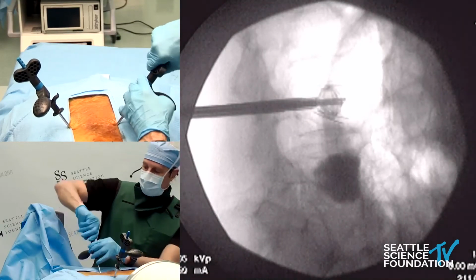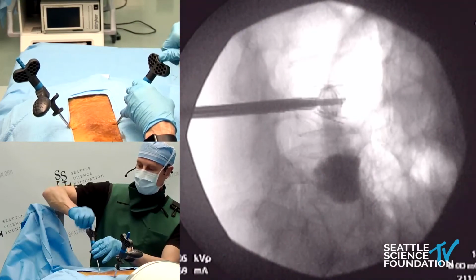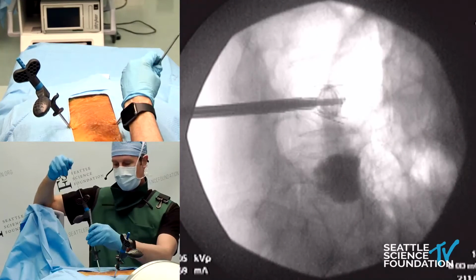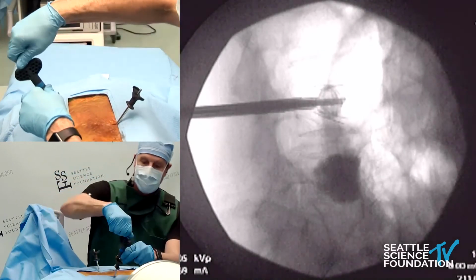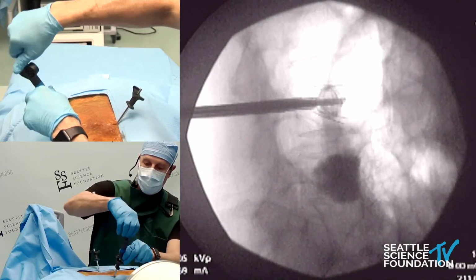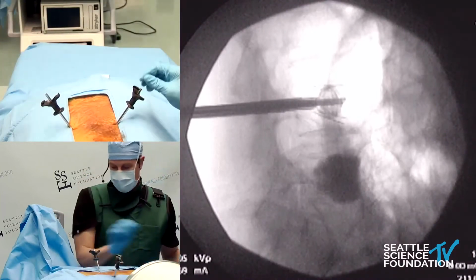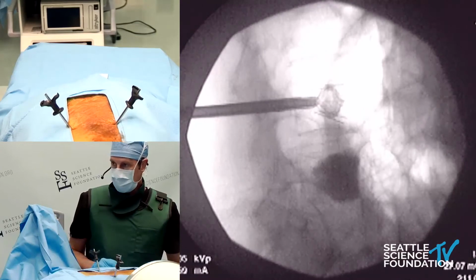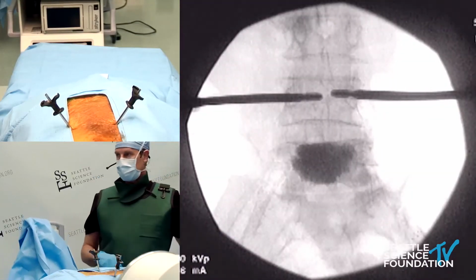I'm going to take the pressure off, 1 turn here, and then 10 turns for the color tube. We're going to pop this off. And same on the other side. Both off. Shot there, and let's take an AP before we fill it with cement. And that's exactly what it should look like.